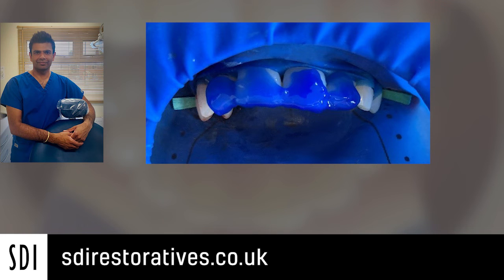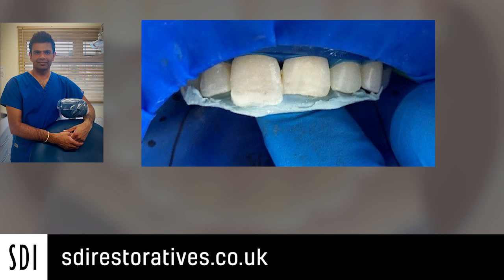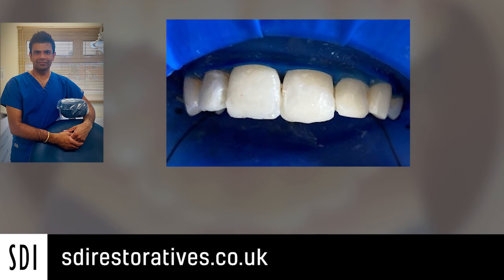The teeth were built up one by one. The slide shows the first tooth to be built up was the upper right central incisor and we use the putty guide just to create a good palatal form, which I find is the easiest way for me to do this. Then just individually building up each tooth, which helps to ensure there are good contacts and there isn't any joining of the composites.